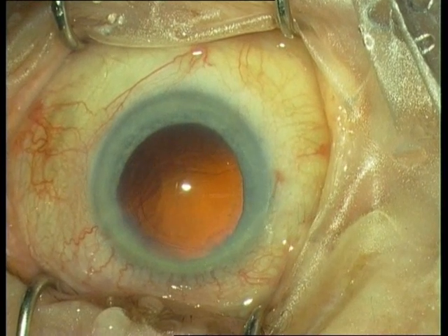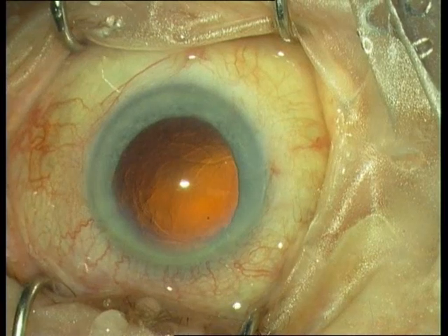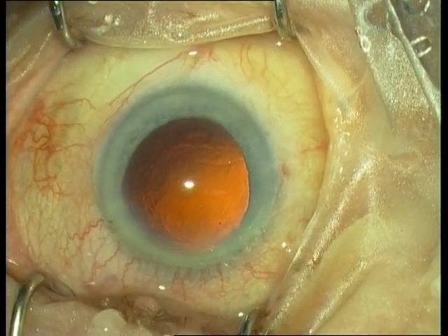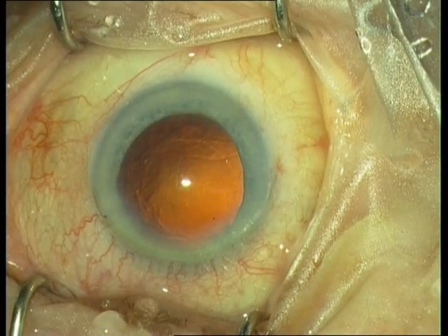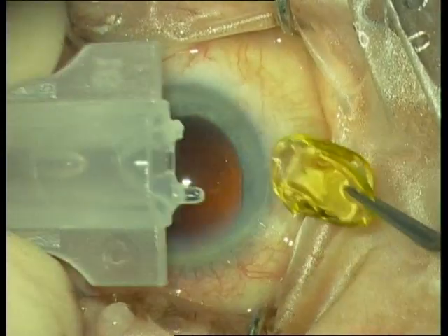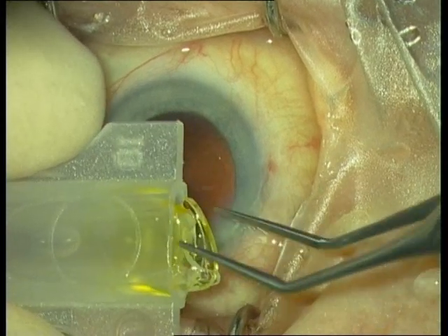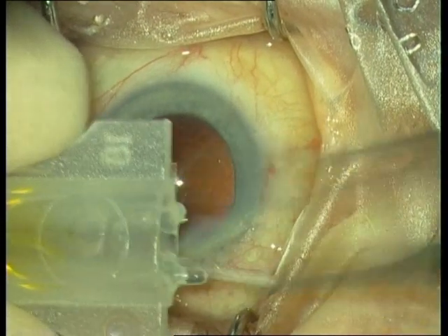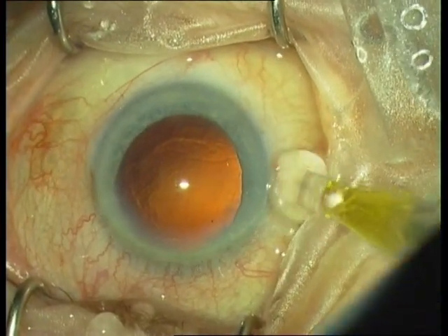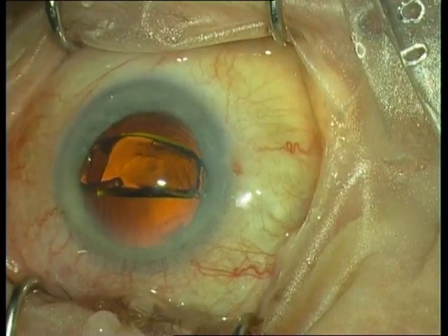The next step is the implantation of the IOL. First, injection of viscoelastica through the paracentesis to inflate the capsular bag. Then implantation of an IOL — one piece or three piece. This is a one-piece IOL, which is easier to implant. Look at the drawing on the cartridge, which shows the correct implantation of the IOL into the cartridge. Hold the injector like a pencil and insert the IOL.